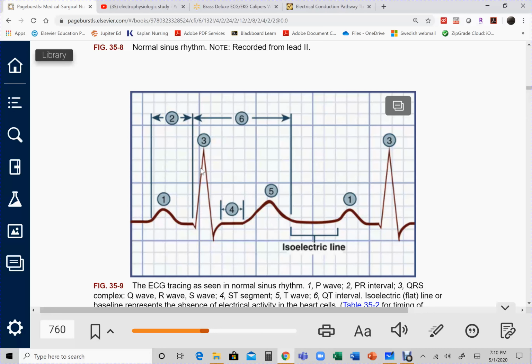Remember that the vertical axis is measuring electrical activity in voltage. So if you compare the electrical activity here, you can see the amount of electrical activity in the ventricles, giving you an idea about the force of the contraction when the ventricles contract. In fact, look, there's more electrical activity when the ventricles contract compared to when the atria contract. Right, so big difference there.